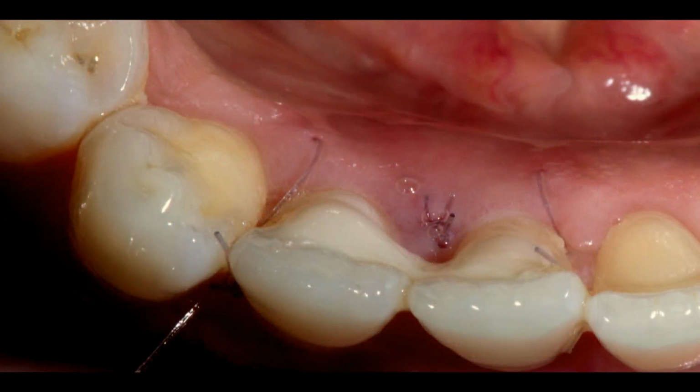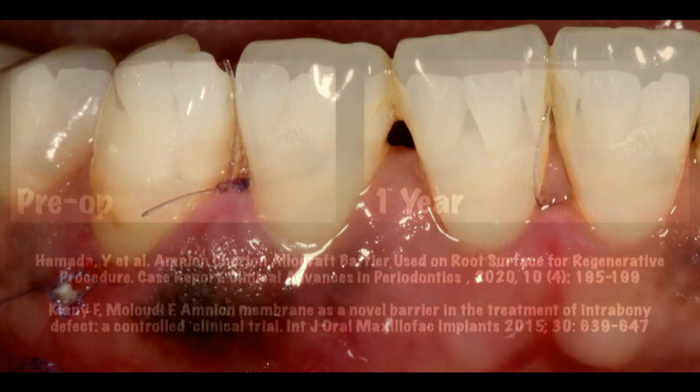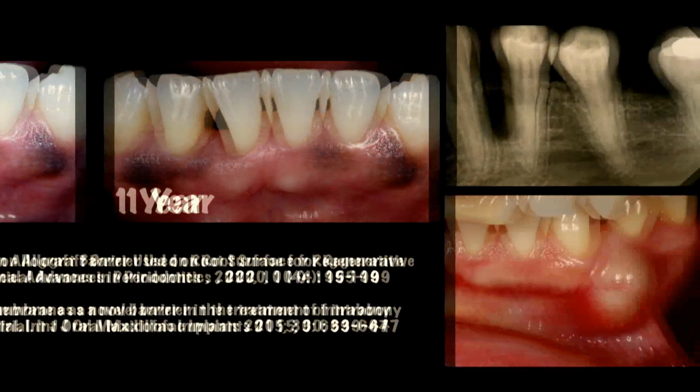You can see my crestal incision was on the lingual side, just to avoid scarring or the risk of things opening. And this is the 2-week post-op. Our sutures are these glycolon sutures that are dyed, so I know this is a 2-week post-op because those sutures haven't lost their dye yet. You can see the buccal view healing very well. And then we have a 1-year post-op. And again, there's great literature here on using the Amnion-Chorion for GTR.